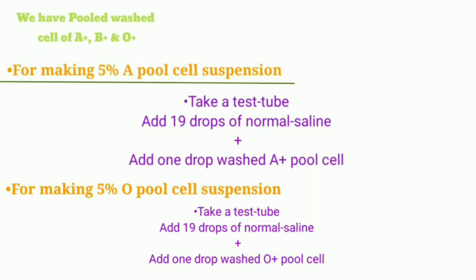For making 5% A pooled cell suspension, we take 1 test tube. In this test tube, we add 19 drops of normal saline and 1 drop of washed A positive pooled cell. Mix well, and after mixing, we have prepared 5% A pooled cell suspension.